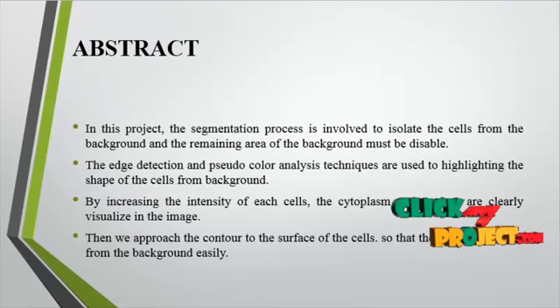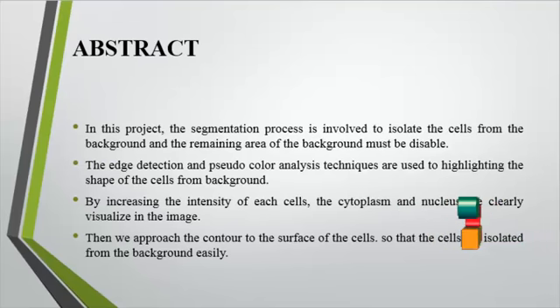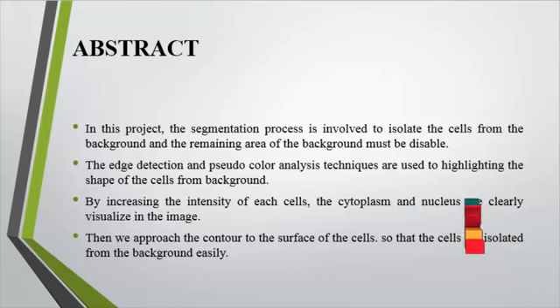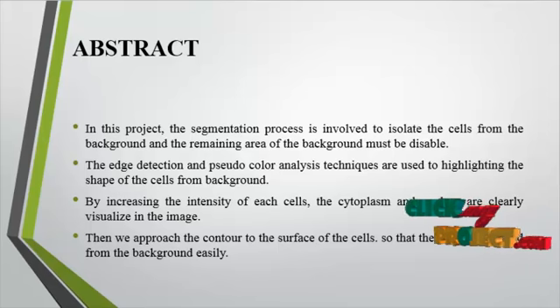Now we discuss the abstract. Cytological screening is widely used for detecting cervical cancers. In this study, a semi-automatic PC-based cellular image analysis system was developed for segmenting cells, with clear cytoplasmic contour and texture features fed to support vector machine classifiers to classify the different types of cells. Two experiments were conducted to verify the classification performance.